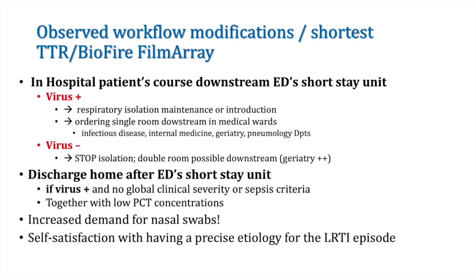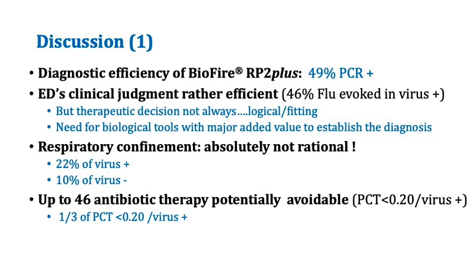This was probably a surrogate of the added value of knowing very quickly whether or not the patients had a viral infection. Globally, there was very high satisfaction for physicians having a precise etiology for the LRTI episode. It was true for the physicians, but also for the patients. So if we discuss these results globally, the diagnostic efficiency of the BioFire respiratory panel in this experience was 50%.